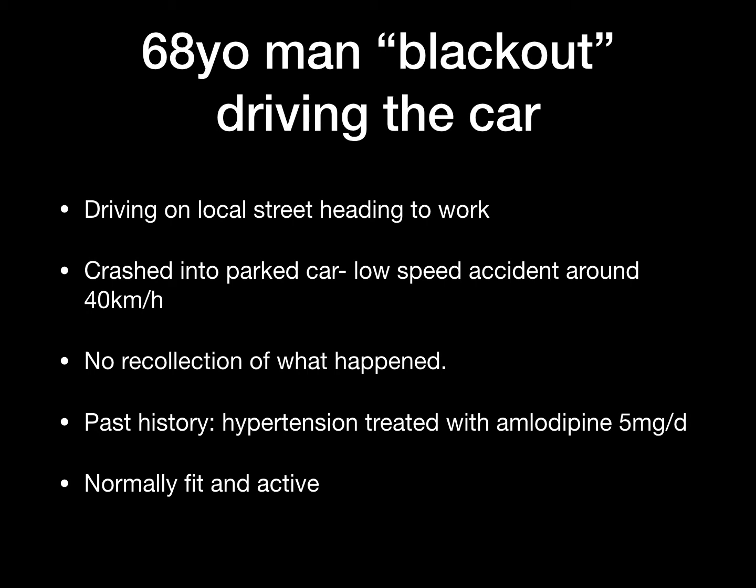So the take-home message here is that the abnormal ECG itself predicts a very high likelihood that this gentleman has underlying cardiac disease. It also predicts a much higher likelihood that this episode of altered conscious state is much more likely to be arrhythmic, including things like complete heart block, and therefore requires a lot more cardiac investigation.